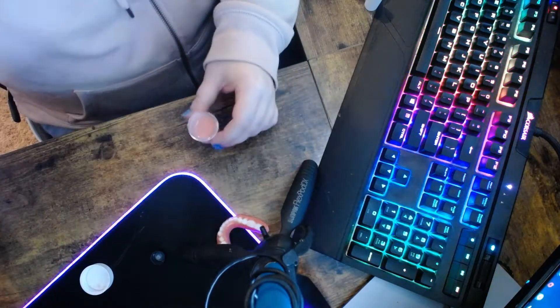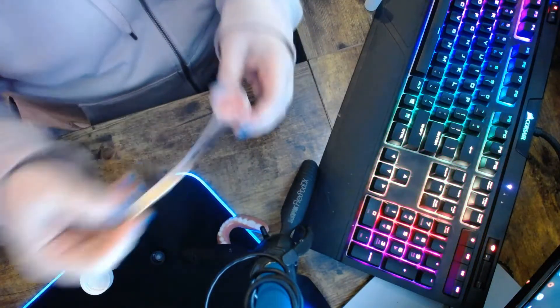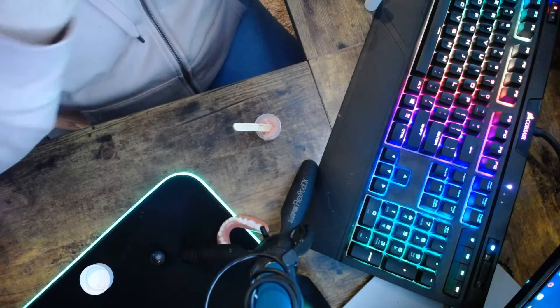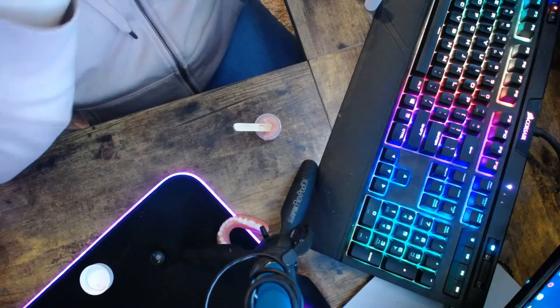I'm going to get my popsicle stick — this is starting to get sticky. That's about the consistency that we want. So I am going to get my lower, put that inside of my face, and we're just going to take the ProSoft and let it flow all the way around. Let's see if this works.